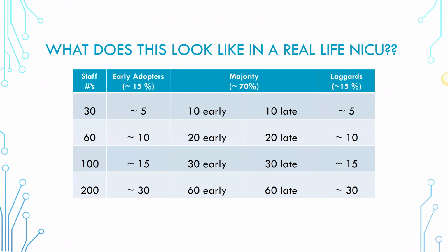So whether this is a bedside nurse noticing a change in the background pattern, or maybe a suspicious area that they think might be seizures, or maybe that's you as the medical provider for that baby overnight needing to notify neurology that you think you see something that looks suspicious. So creating a criteria for notification is important, because again, it's a tool at the bedside, but if the information only stays there at the bedside and there's no communication, it doesn't really serve us very well.